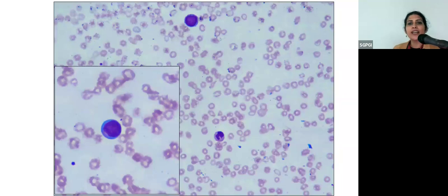Looking at them, what do you think? Are they normal cells? Are they reactive lymphoid cells? Now the alarm bells were ringing and we really thought, are we dealing with a blast population, right? Though it was not 20%, yes, they were looking very atypical. They had a high NC ratio and basophilic cytoplasm, and some of them did have good nucleoli. So we were thinking of whether we were dealing with a leukemia. Even in the peripheral smear, we could see dysmyelopoiesis. So there was dysmyelopoiesis and there were blasts.